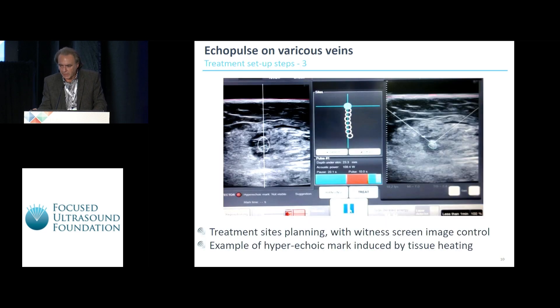Here you can see the treatment sites planned on the screen — in the middle of the image with a witness screen image on the left, and a hyperechoic mark induced by tissue heating on the other side.